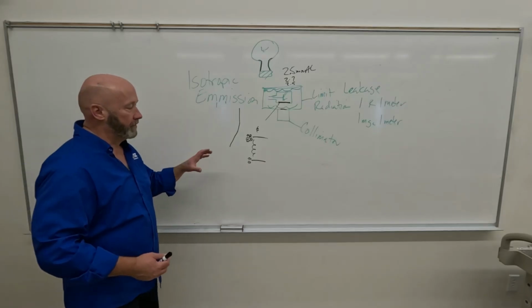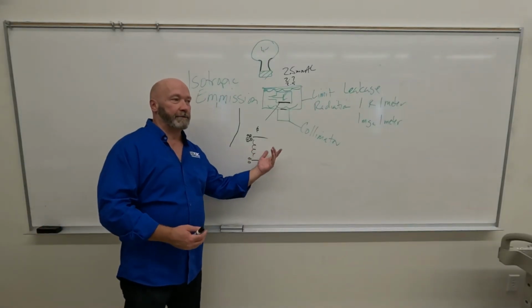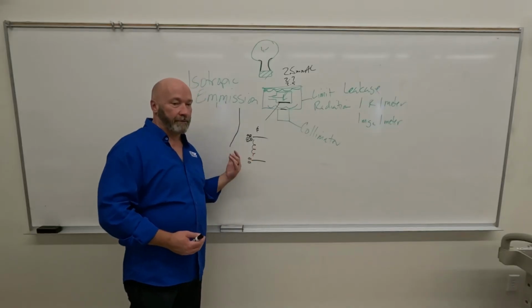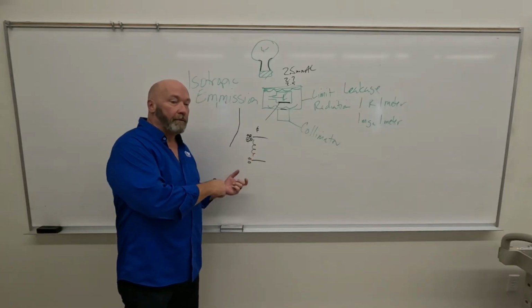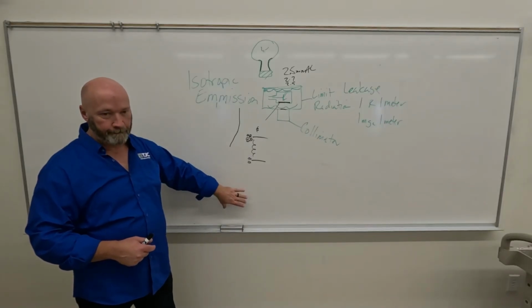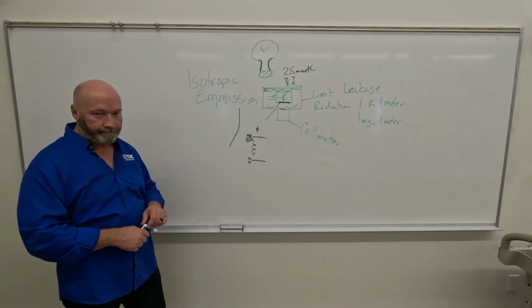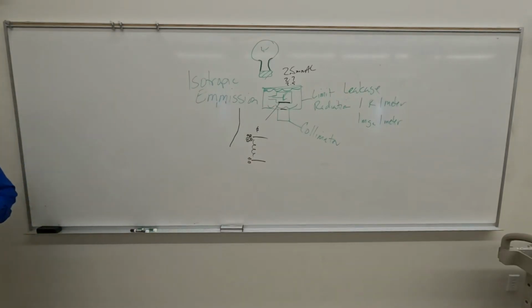In both cases you've got very high mA, but in one case you're talking about the actual exposure that you can create. With the blooming, you're talking about the resulting loss of sharpness of recorded detail. Got it? Ish. So always associate blooming with loss of sharpness of recorded detail.